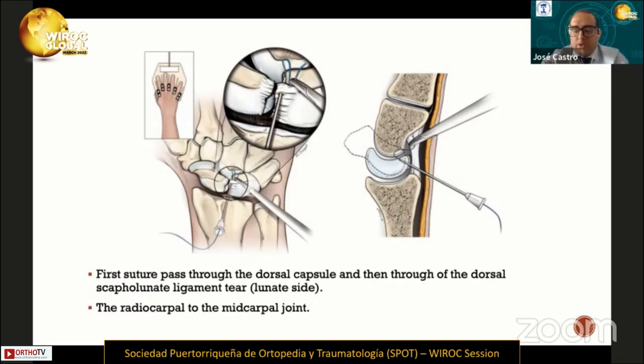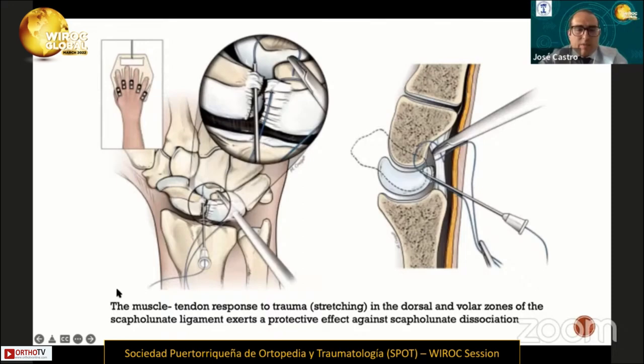The second step is performed in the same way as step one, but on the scaphoid side. The main advantage of this procedure is that you preserve the dorsal capsule, and the muscle and tendon response to trauma on the dorsal border of the scapholunate exerts a protective effect against scapholunate dissociation. For that reason, it is very important to protect the dorsal capsule.